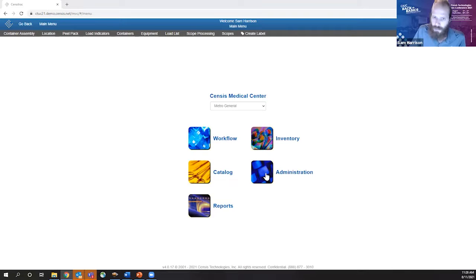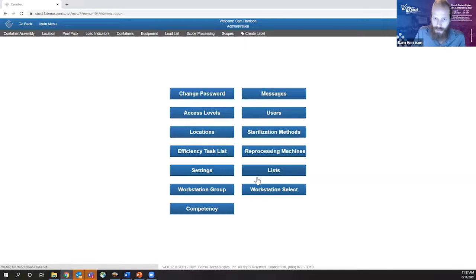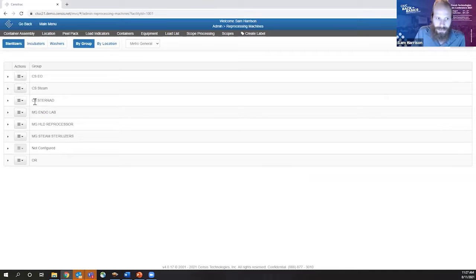Sure. I mean, it might not work everywhere, but if it works for your process, and I understand what you're saying, you have options, right? You have the location scan, like Kelly was saying, you have the quality feedback, or I think what you were getting at was putting it right here in the group settings.